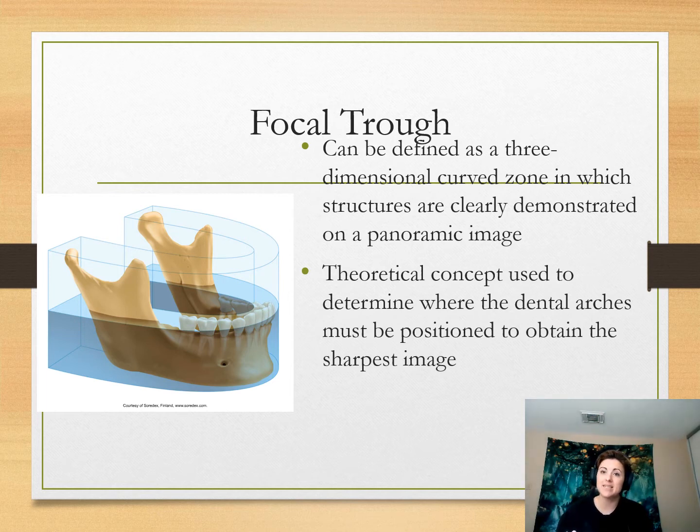Every panoramic that is made sometimes has slightly different variations as far as where you're supposed to place your patient. Most of them are pretty similar, and we'll talk about some of those concepts in this chapter. But if you're using a brand spanking new machine, it's always a good idea to check it out and see what they want me to do with my patient.